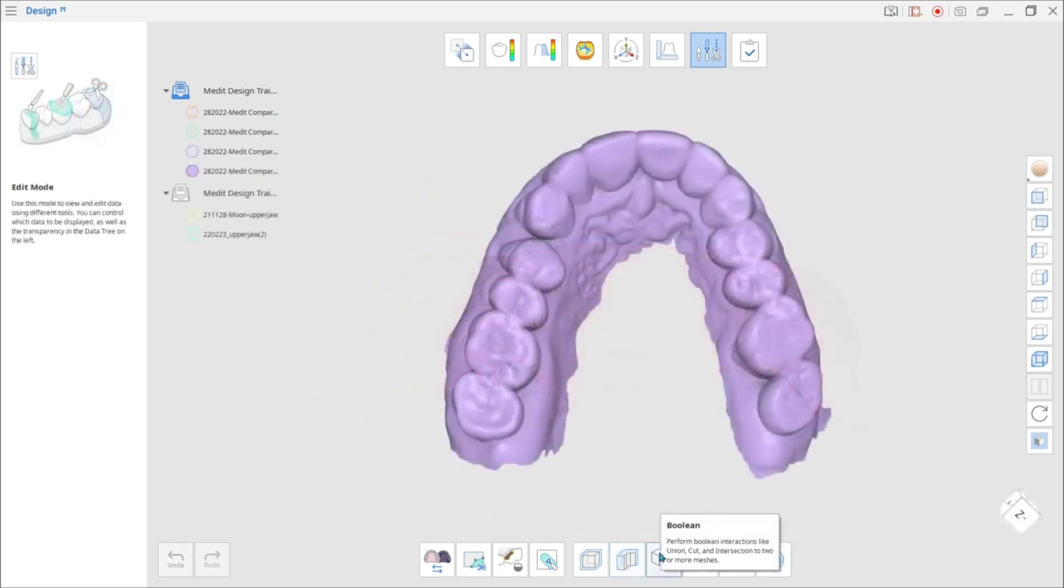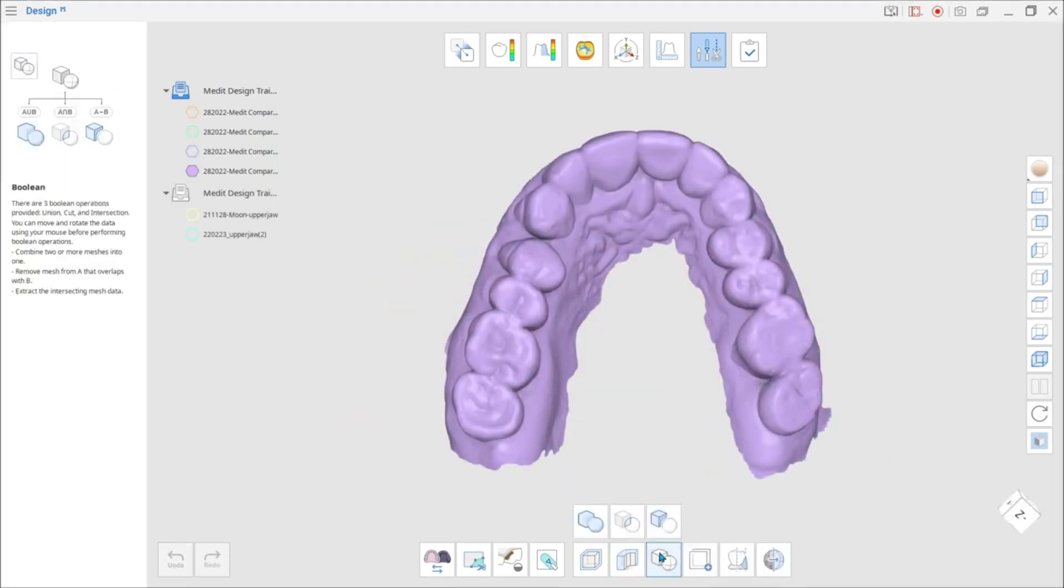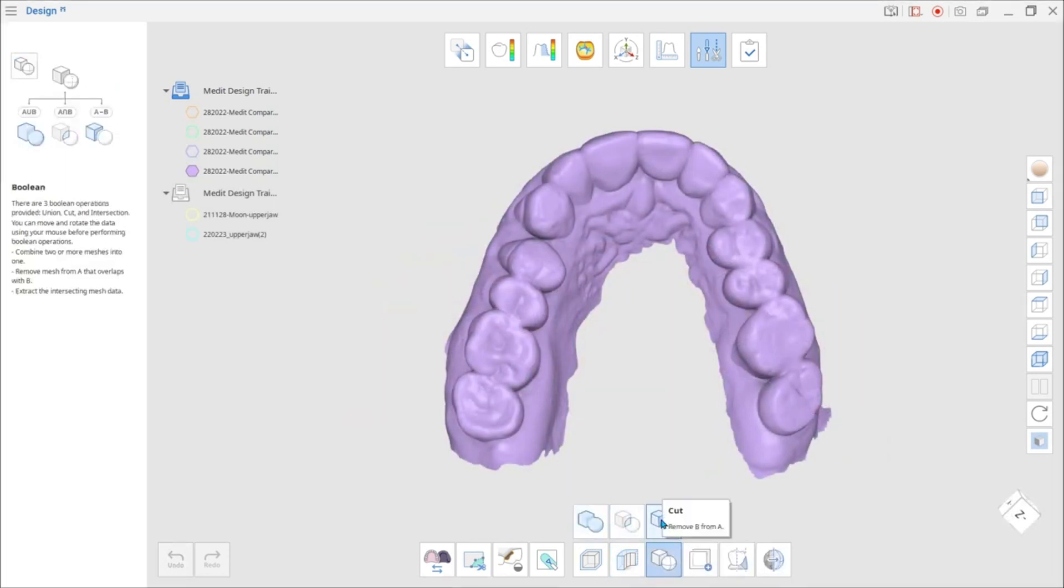Next, we will talk about the Boolean feature. With this tool, you can combine, remove, or extract the intersecting mesh data.